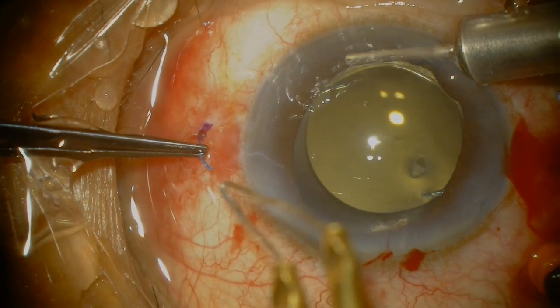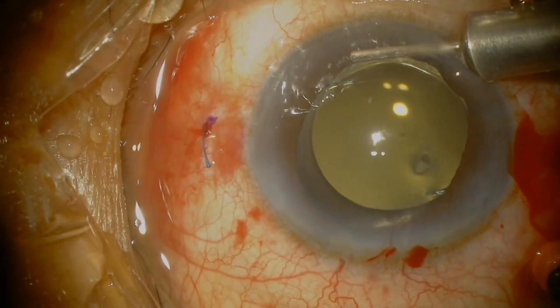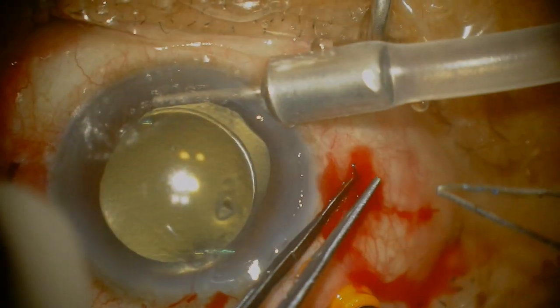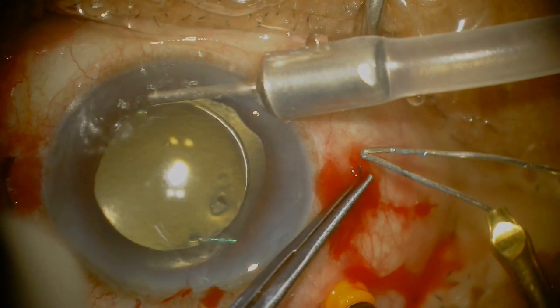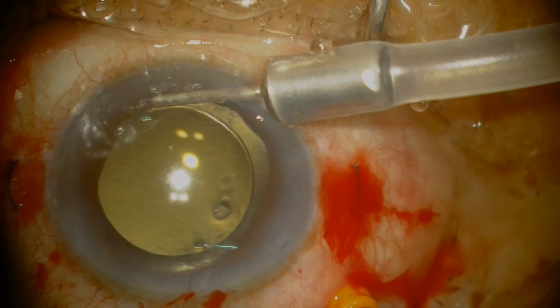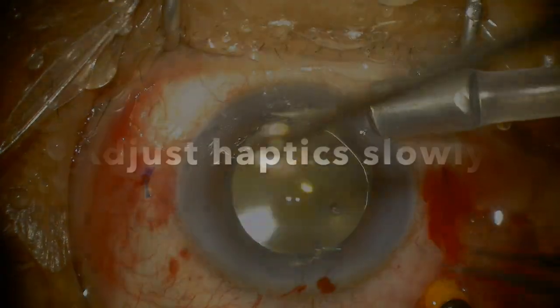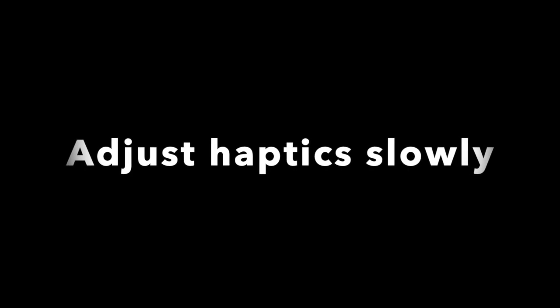As you use your handheld cautery to create the little flanges — you don't need a big one, you don't touch the tip, you just have it hot enough to bring close to the tip — and you get a little small nub as you see here. Using a 30 gauge needle you don't really need a big flange, and this allows it to be pushed back into the scleral tunnel very nicely.